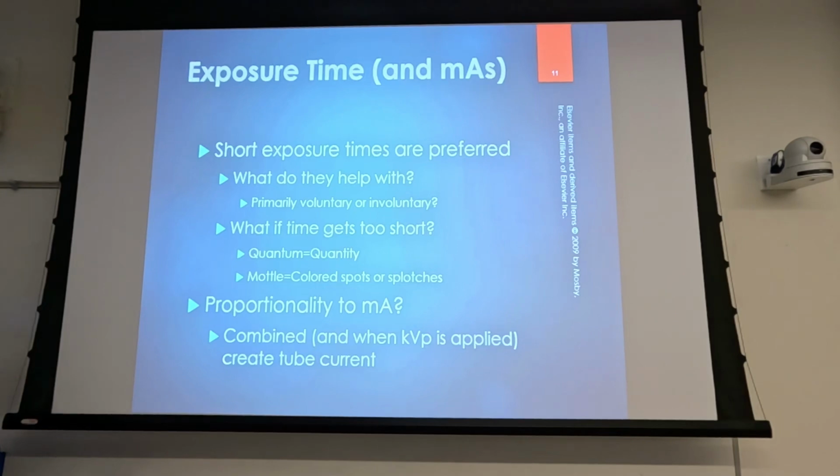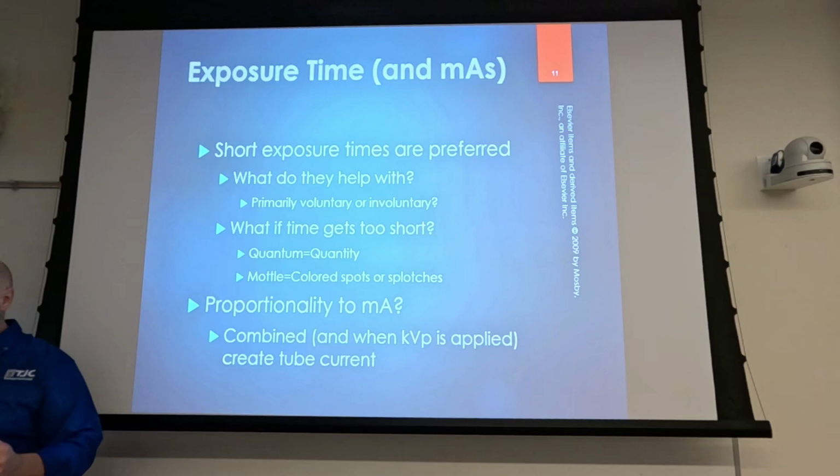And this was done in a dark room with a red light. And so I had the students come into the dark room with me. It's a small dark room, so I only have 2 or 3 of them at a time. And I'd take a film out and I'd put it on top of the counter, and I'd put my hand on the film and I'd tell one of the students to flick the lights. And they'd flick the lights on and off real quick, and I'd take the film and I'd put it in a processor, and what would come out is the film would be totally black except for where my hand was, and then it would be clear there, right? So my point in doing that exercise was, lock the darkroom door, because if somebody walks in and you've got that film bin open, you're going to expose all the films in the film bin, and it's going to cost us a lot of money.